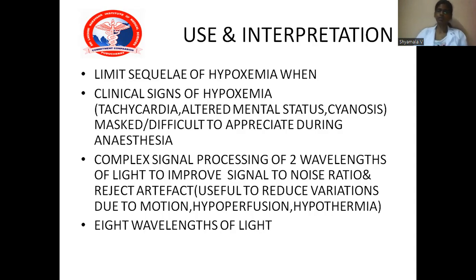So coming to the uses and interpretations, it limits the sequelae of hypoxemia before the clinical signs of hypoxemia can occur, like tachycardia, altered mental status, and cyanosis, which may be masked or difficult to appreciate during anesthesia.